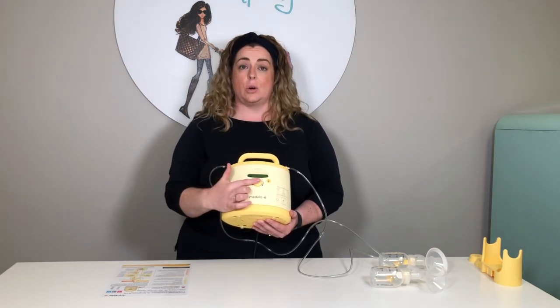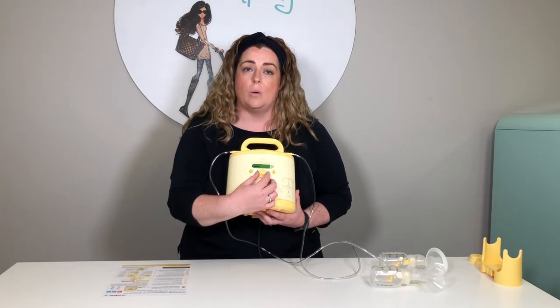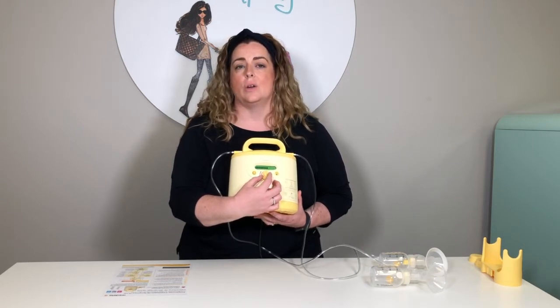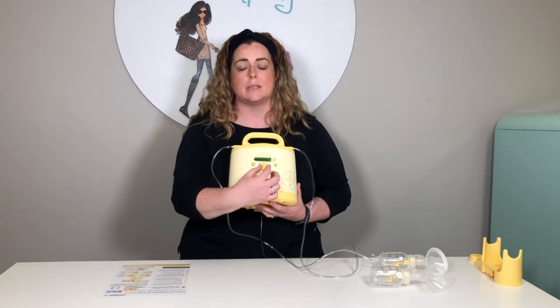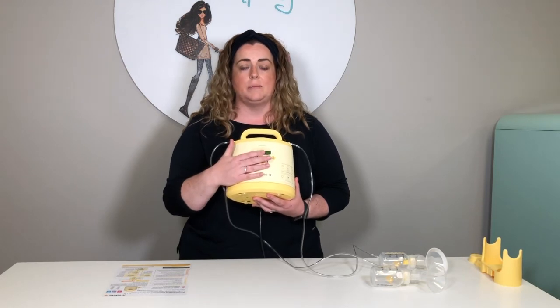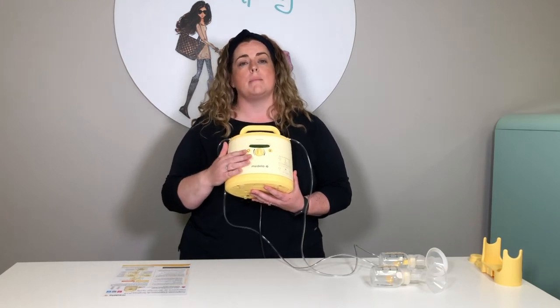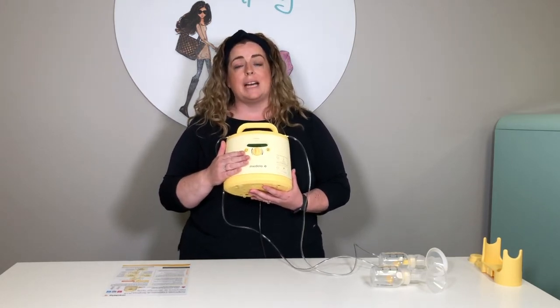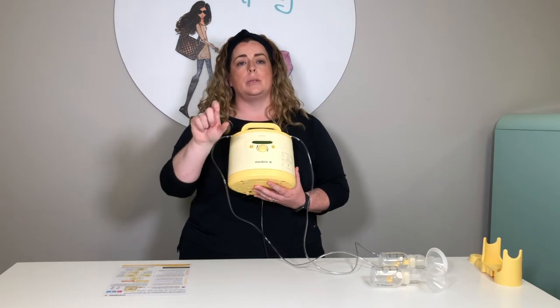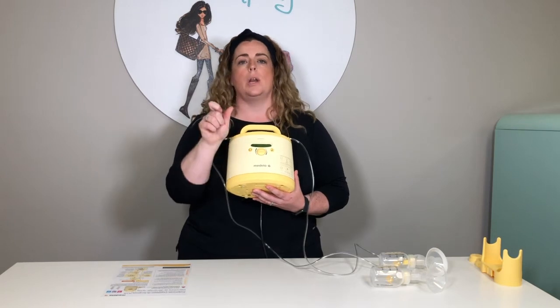So this is your suction level. The camera should pick it up, but you will be able to see how, as I go up, the noise also increases. And as I increase, the suction level increases. So as the noise increases, the suction level increases. When you turn the suction level, you don't have to go all the way up to the highest level. What we suggest you find is called maximum level of comfort. Maximum level of comfort simply means that you gradually turn it up, turn it up, turn it up until you go, ooh, now I can feel it. And then you turn it back down one notch.